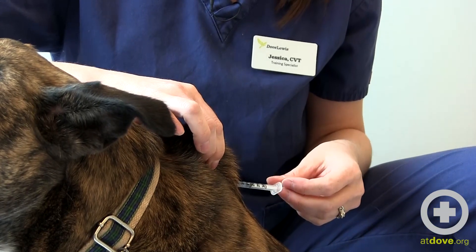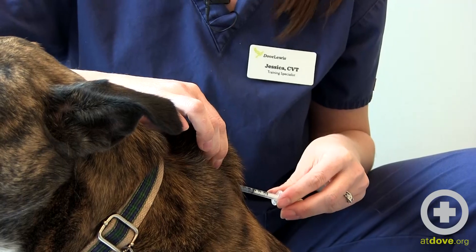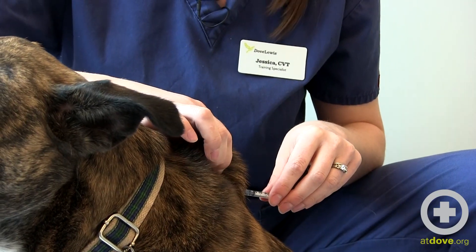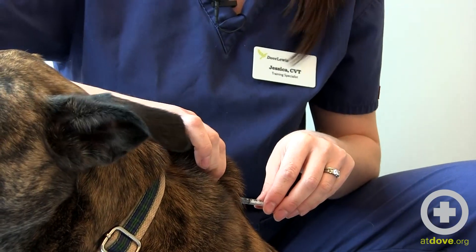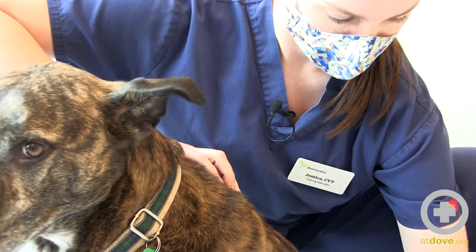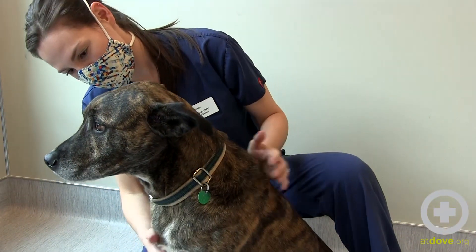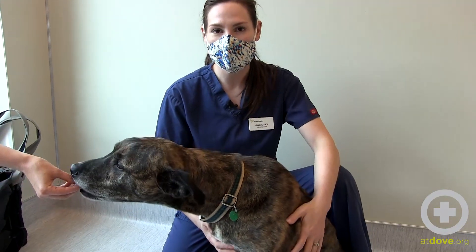Insert your needle into that tented skin and draw back just to make sure you don't have any blood — if you do, you may have hit a small vessel and you'll want to start over. I see no blood at the end of my syringe, so I'm going to inject slowly, pull my needle away, and give him a little praise for doing so good. And that is how you give insulin to a dog.